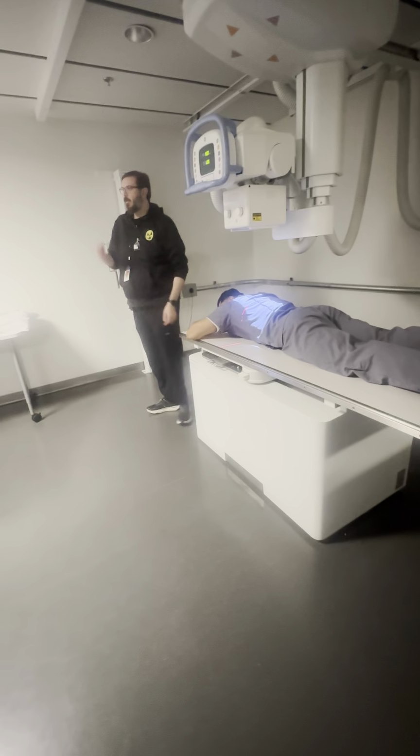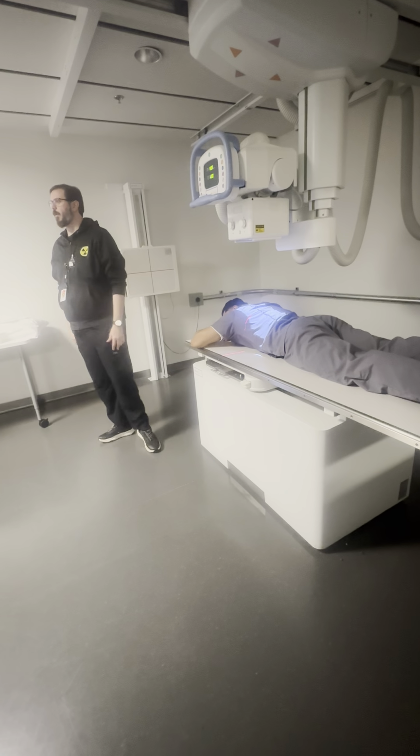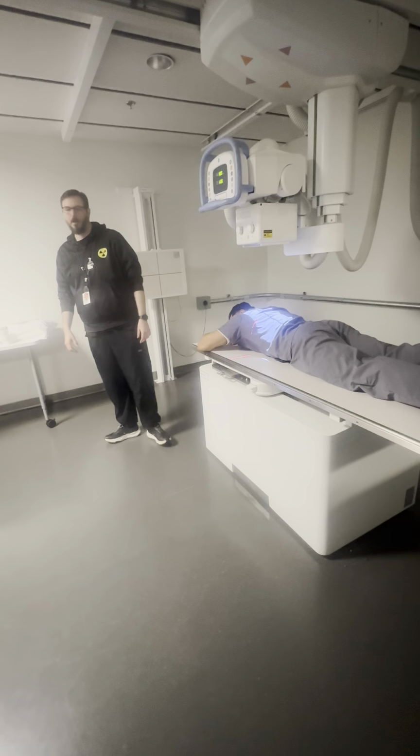And you keep that same collimation of 17? Yep. Better to give the doctor more information, especially if you're doing a scout film or something, right?